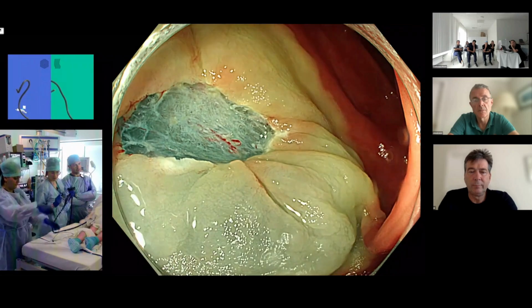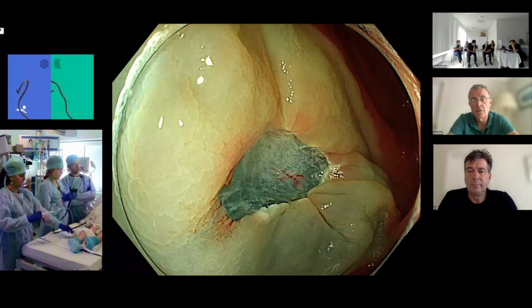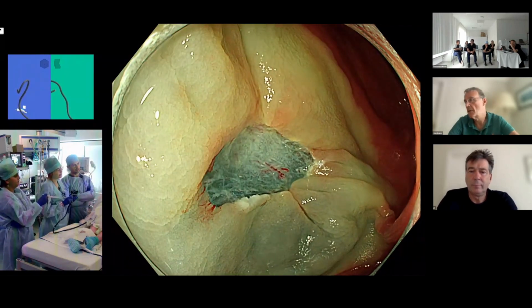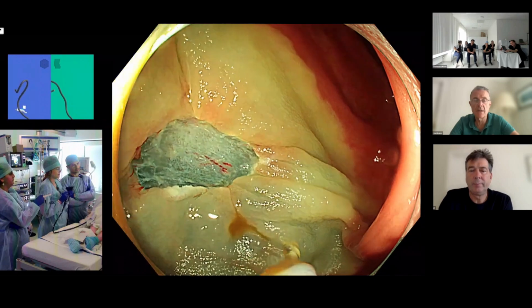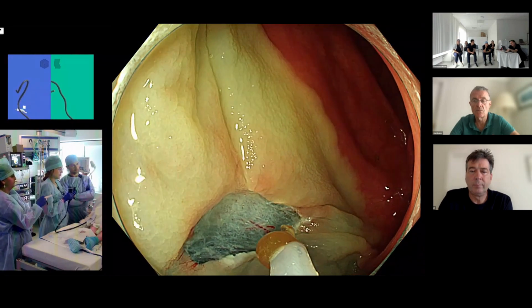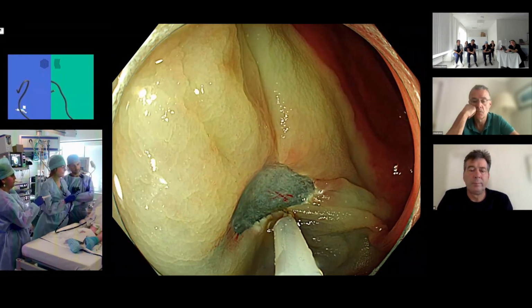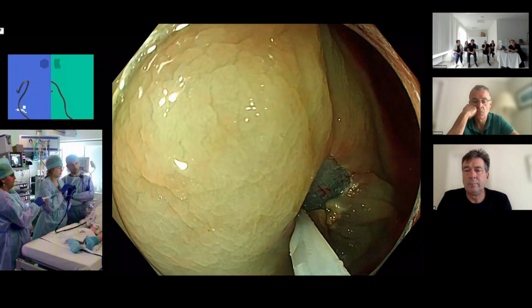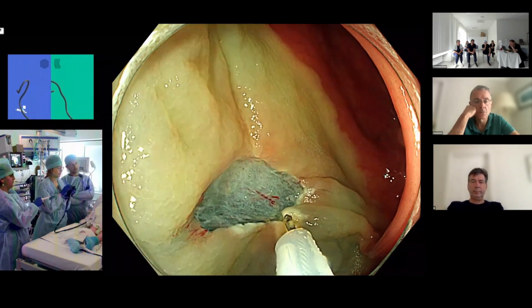And finally, while she's doing that, please can we discuss the pros and cons of clipping here? Other faculty's view on that? So it's right colon, no other risk factors, 15 millimeter lesion. What do we think? John, can you switch your thing on? I mean, I wouldn't clip this, David. There's no risk factors. I must say, I don't think we have to clip it, except for it's in the right colon. But these always bleed. These little en bloc ones, they're the ones that bleed. Not the 50 millimeter one you've done, but the smaller one you've done en bloc bleeds. I don't know, this is just what I've experienced.